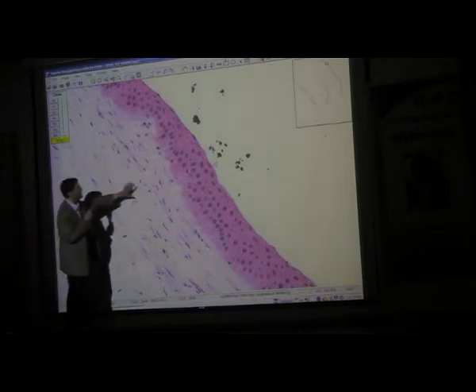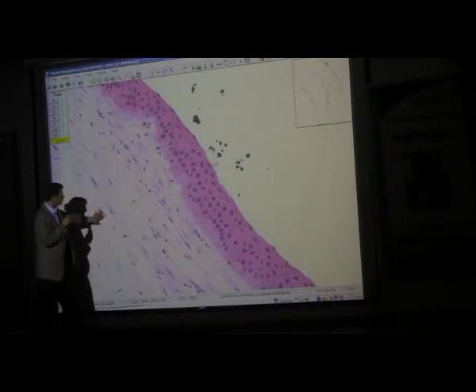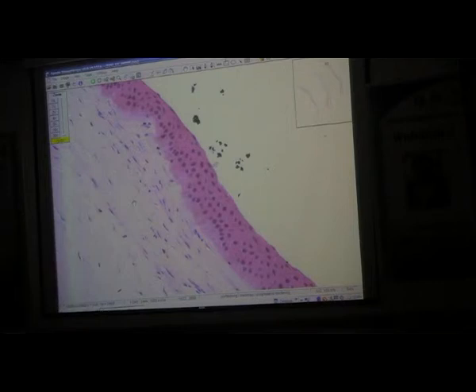And you look, and you see that there are far too many keratocytes. Now the other thing that you see over here is not only do you have far too many keratocytes indicating that there's a scar, but you see a relative absence of those clefts, those artifacts. So this is an opacity. So we have discontinuity in Bowman's layer, and we also have a scar. Now, the interesting and important thing here is we don't have inflammation. This is by no means a corneal ulcer. Okay? So, disruption of Bowman's layer, we have the scar.